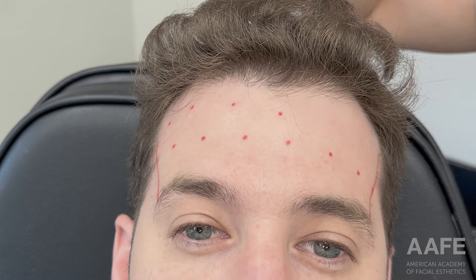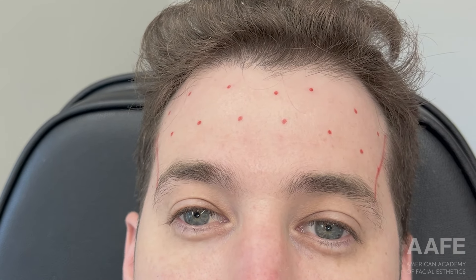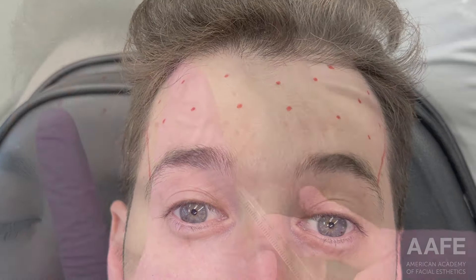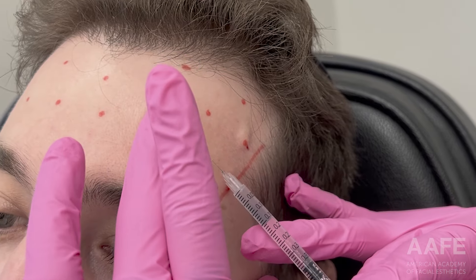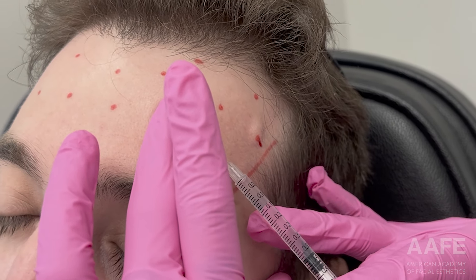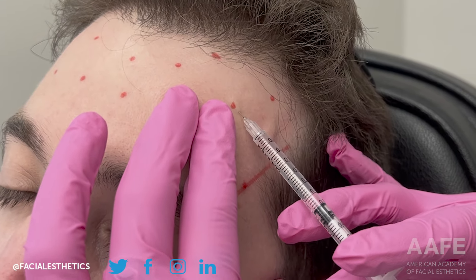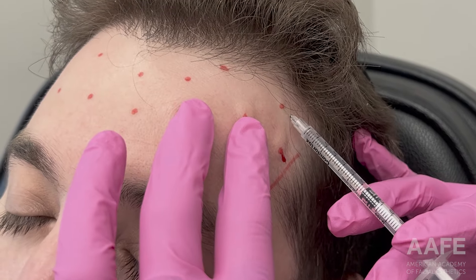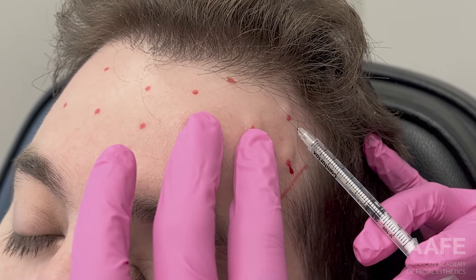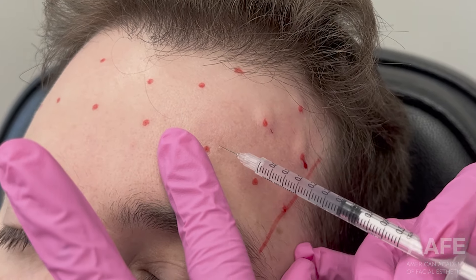I'm making sure I'm treating all the way across to avoid any spocking of the brow. I place my dots evenly throughout the frontalis for an even spread. I'm injecting at a 45-degree angle, using half my needle depth, and watching the tissue — paying attention to any resistance, which means I'm either too deep, too superficial, or the patient just has really good skin.